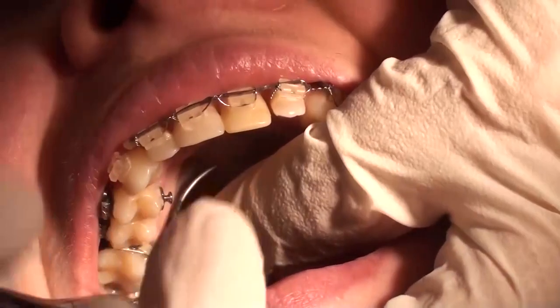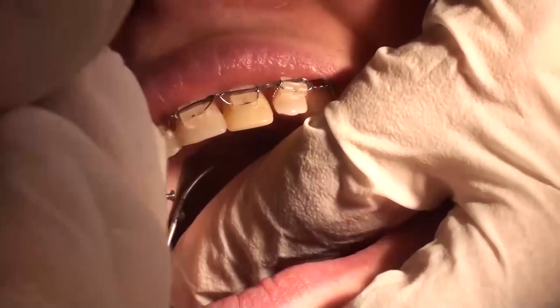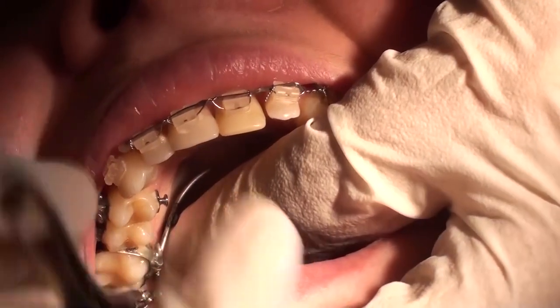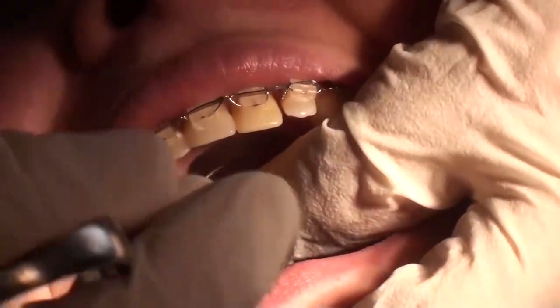These composite cantilevers to bring second molars in are a really very nice system, because working from the buccal side is very difficult.